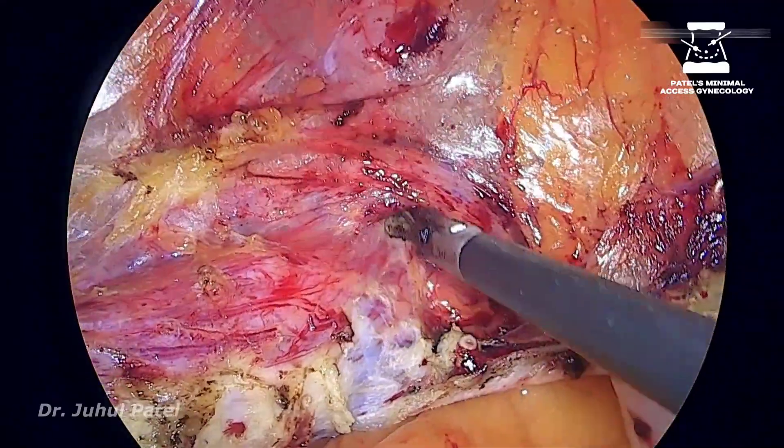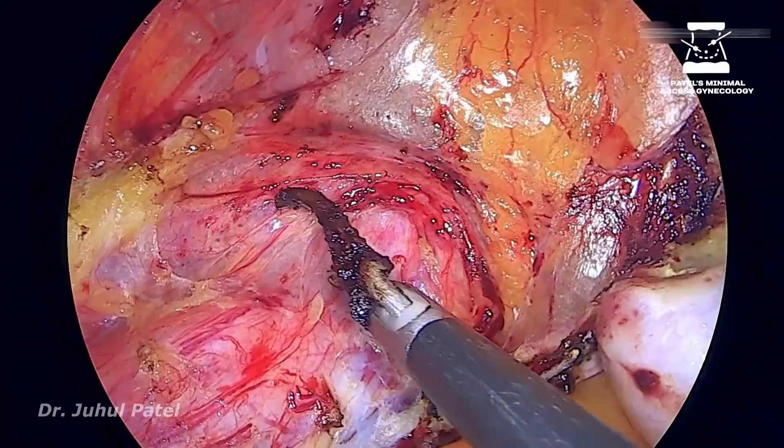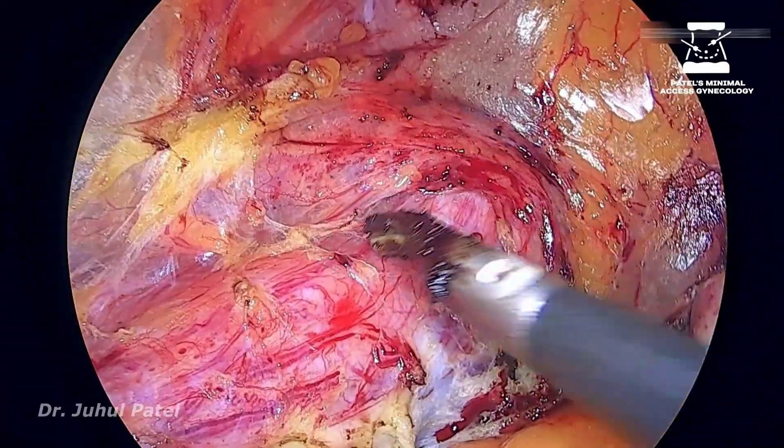As you all can see, this lady has a pretty long cervix. I think she must have had prolonged labour.